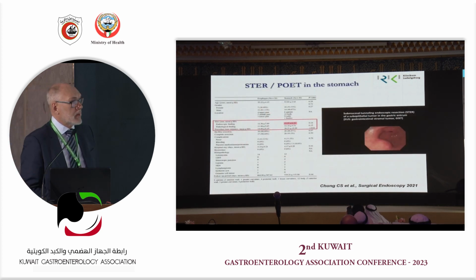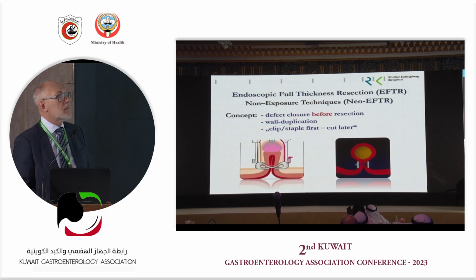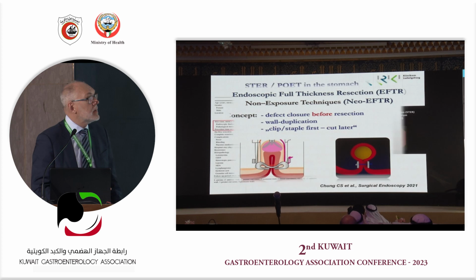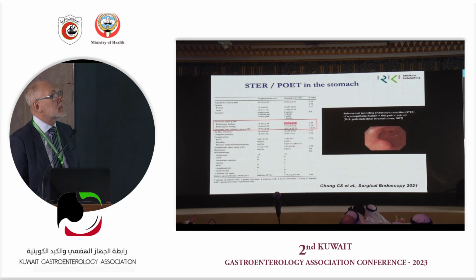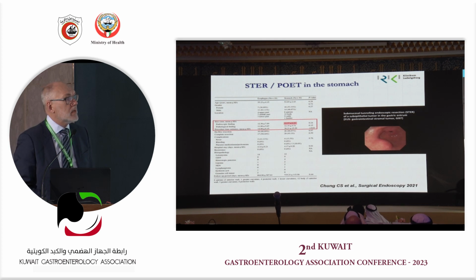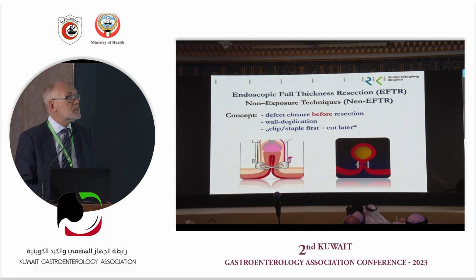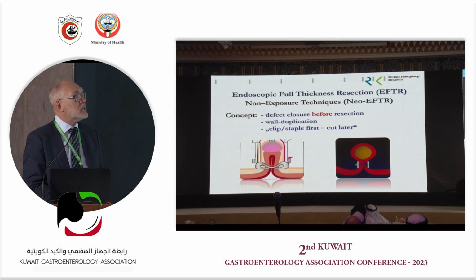How about the stomach? In the stomach, it's a little bit different. But it's a little bit tedious because the gastric wall is so thick that it's hard to take the thing out. So we're coming to these non-exposed resections.